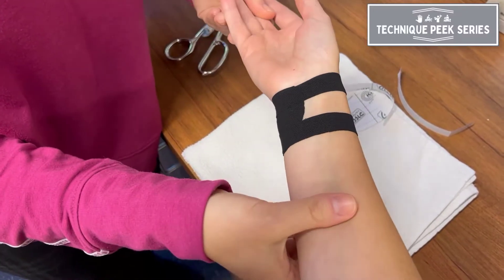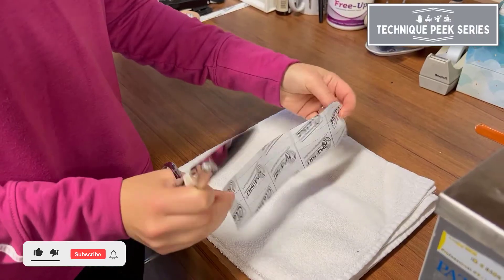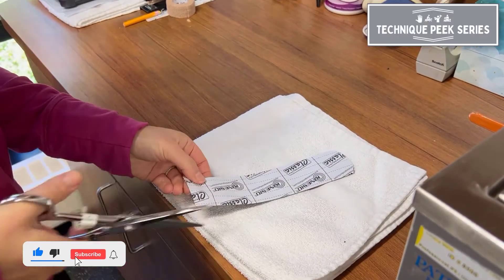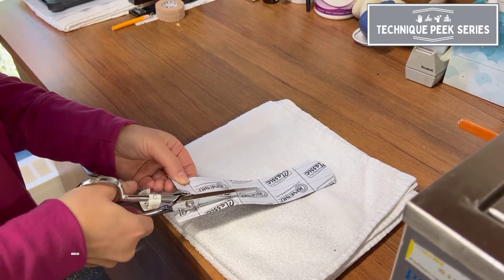Today we will demonstrate a taping technique for a TFCC injury. First, you will want to cut a U-shaped pattern in your tape to create two tails which will wrap around the wrist.